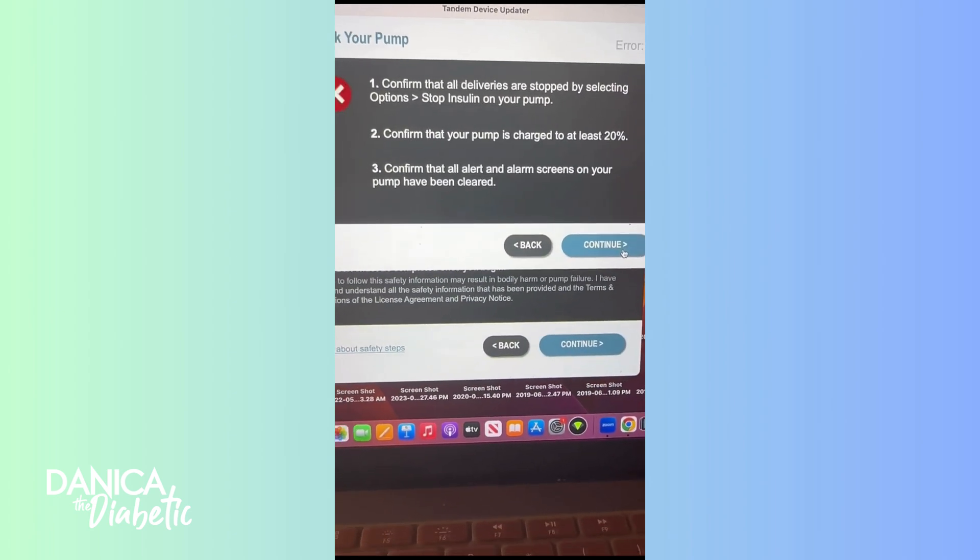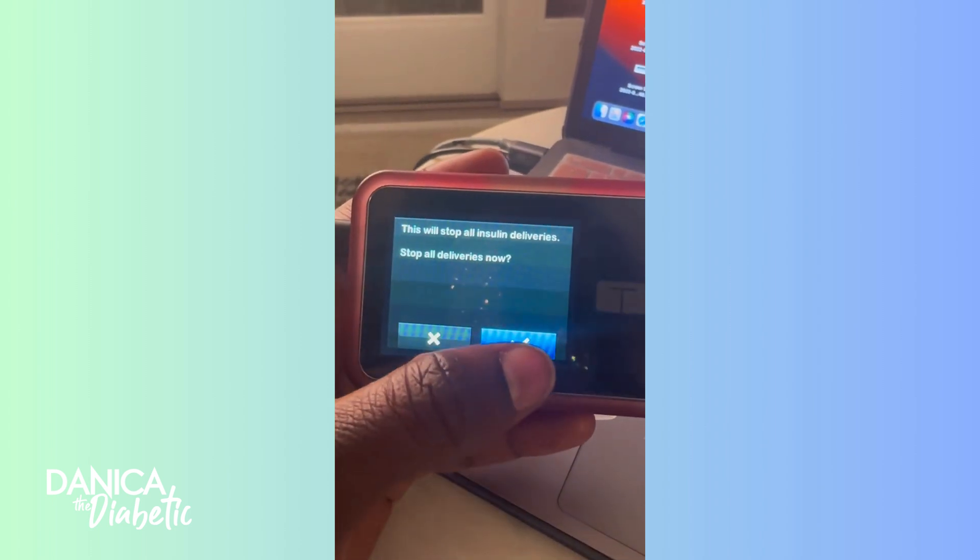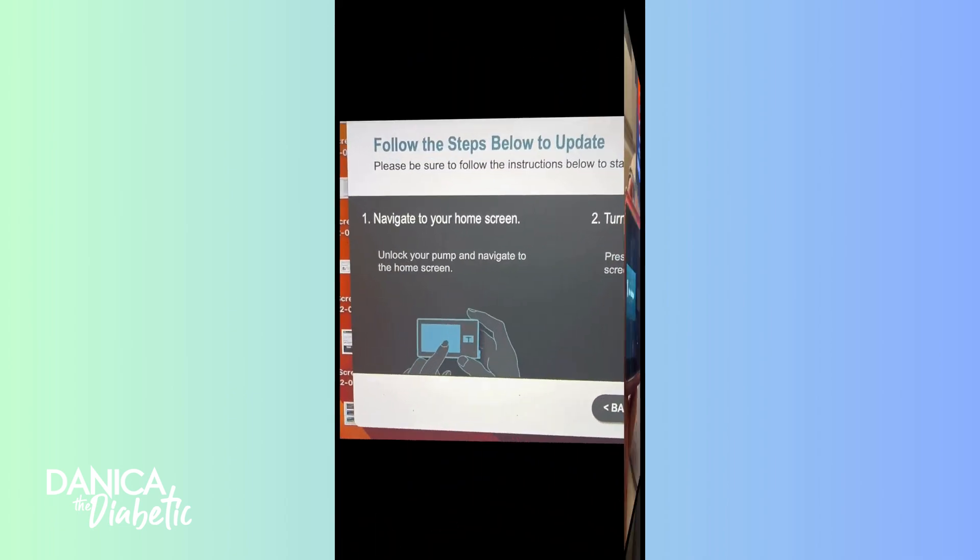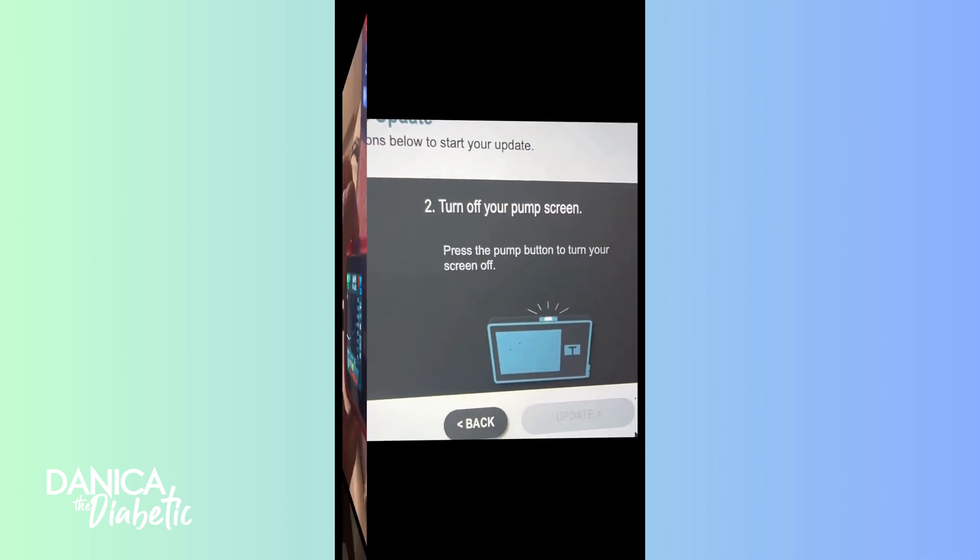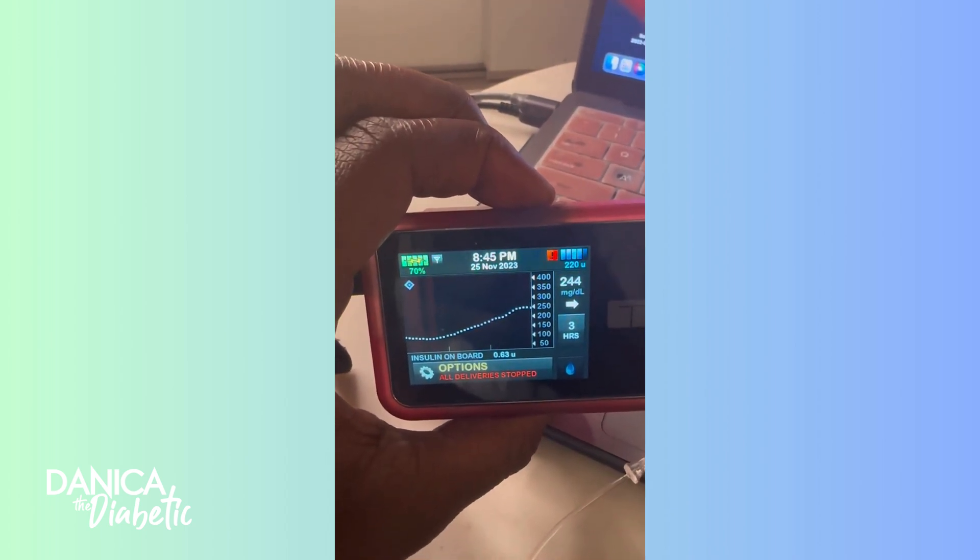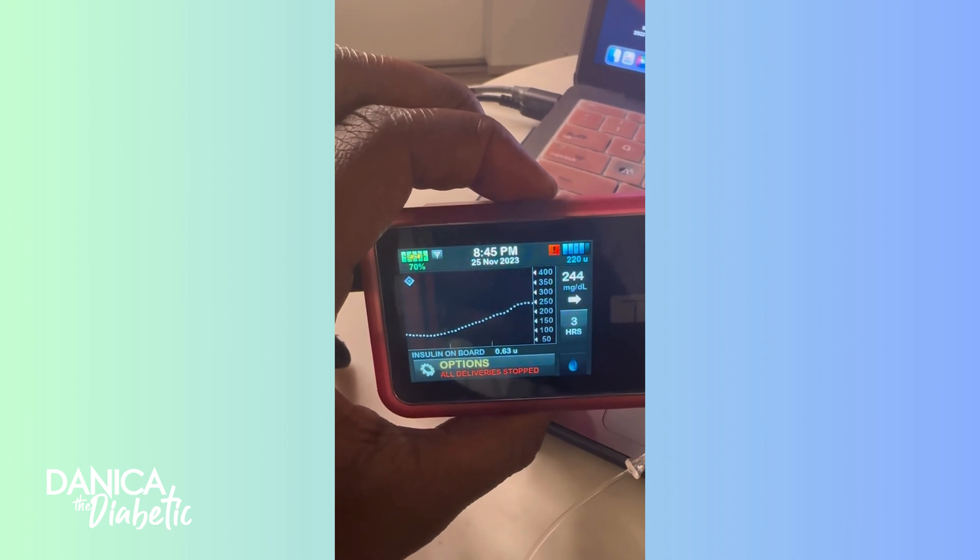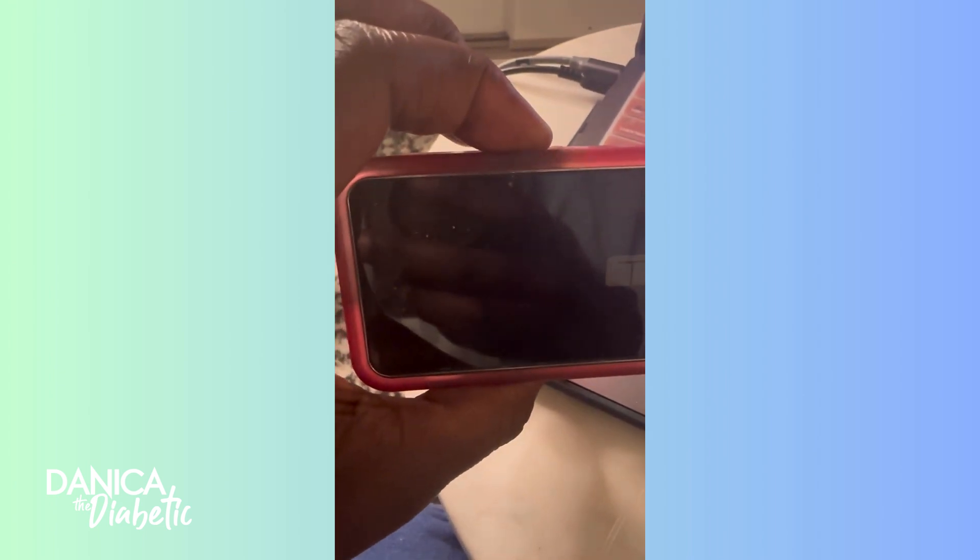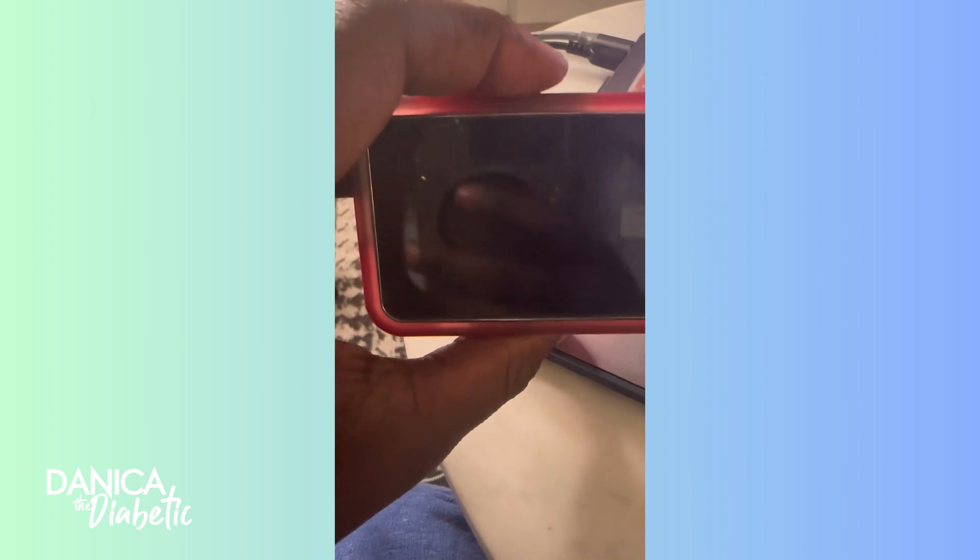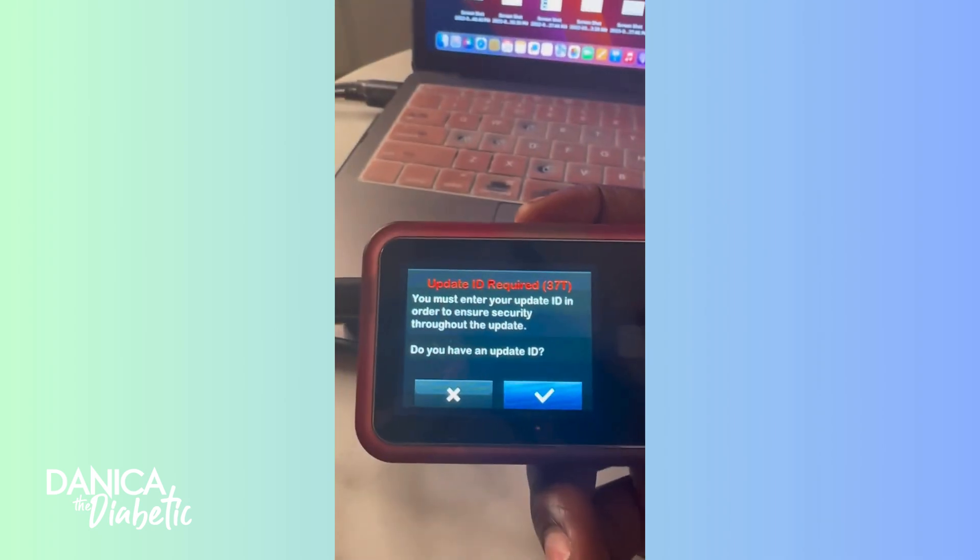It goes over the exercises and so many pieces of it. You need to make sure your pump is plugged in and you have the uploader ready so that you can do the software. Also, when you plug it in, make sure you're disconnected. So you stop all deliveries as you can see here and make sure your blood sugar is okay. Mine was not great, but I still did it.